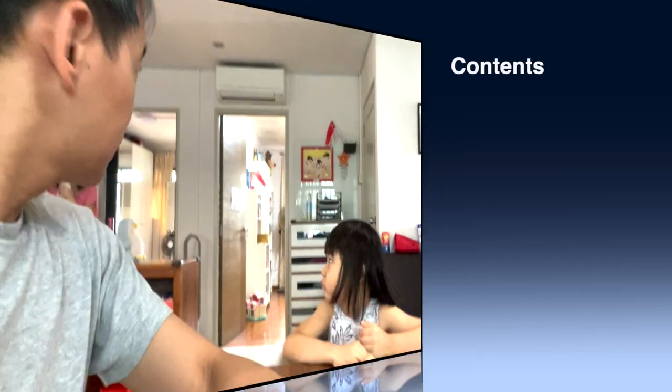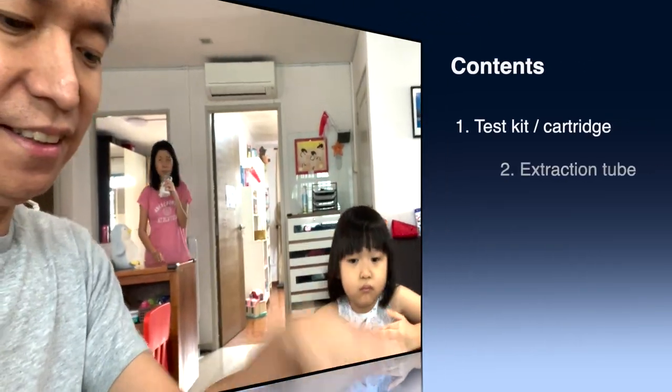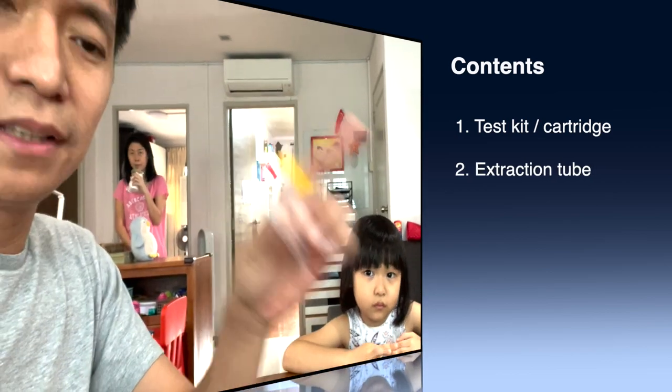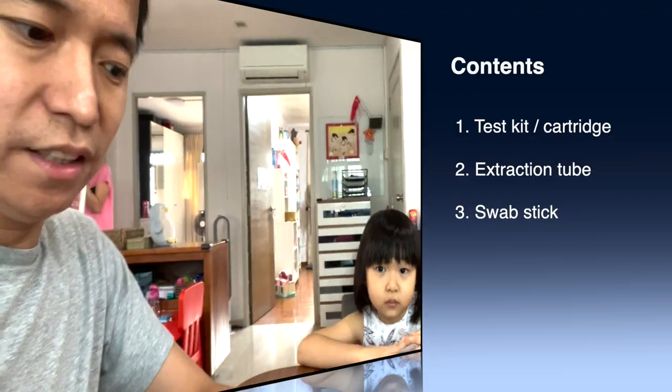Hello everyone, today I am with Pretty Bianca and we're going to do an ART test. I will show you the contents. So there is this test kit, there's the extraction tube as well as a swab stick. Only three things you need.